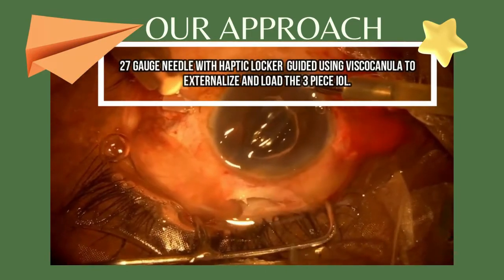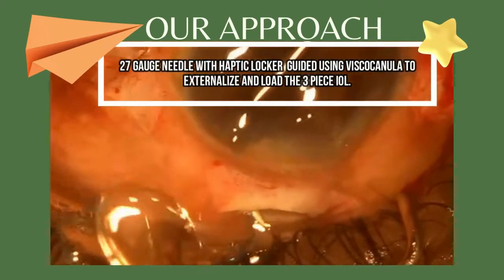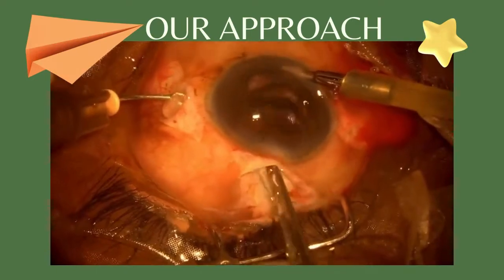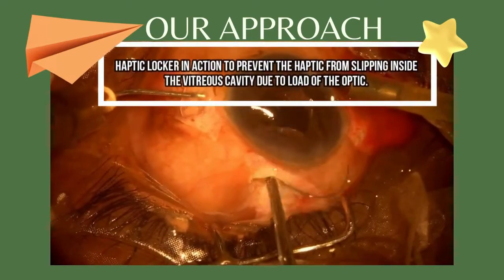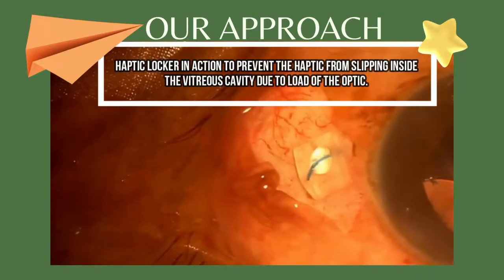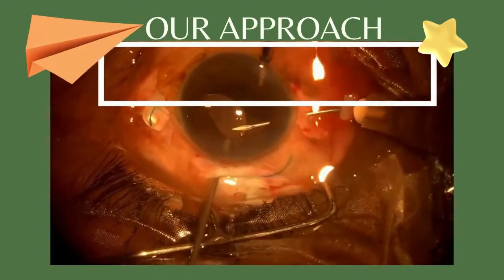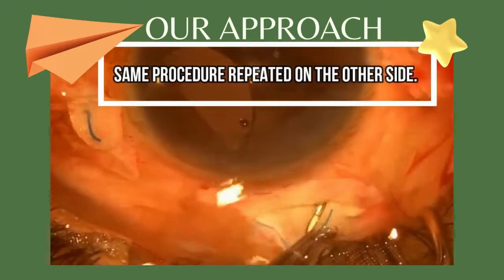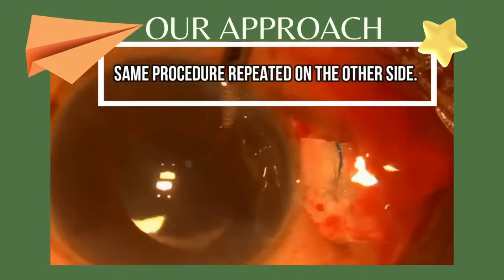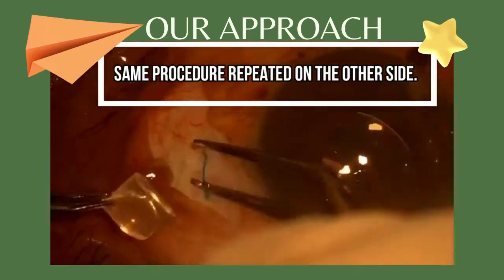This prevents injury to the iris tissues and also to the corneal endothelium. From here on, as previously described, the haptic of the 3-piece lens is loaded into the 27 gauge needle and slowly externalized. Also notice the haptic locks come into action as the needle is withdrawn. The same procedure is again repeated on the other side. And now that both the haptics are externalized, the haptic locks are removed, and with the use of the McPherson, the haptics are grasped and introduced into the haptic tunnels, and the surgery is completed.